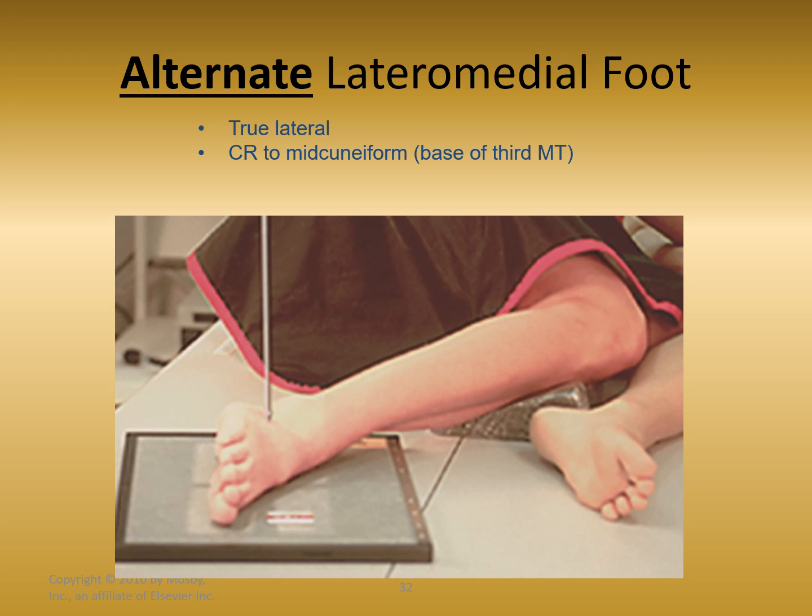The central ray is the same. The criteria of the images are exactly the same. The book mentions that it's easier to get the foot in a true lateral position this way, but the disadvantage of doing it this way is that it's less comfortable for the patient. The advantage to doing it this way is that it will put the foot more easily into a lateral position.